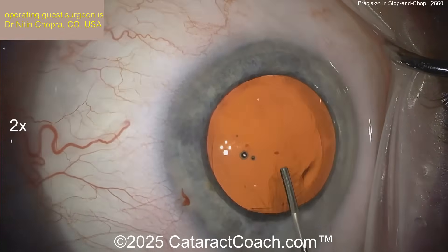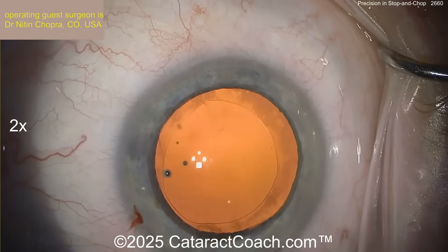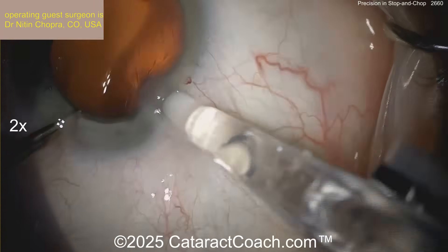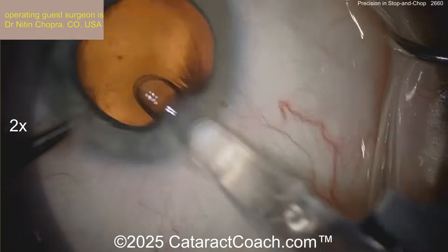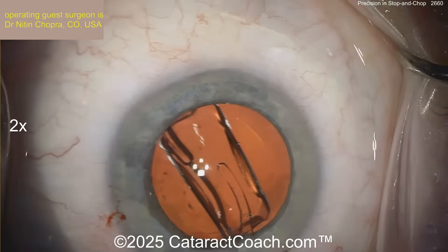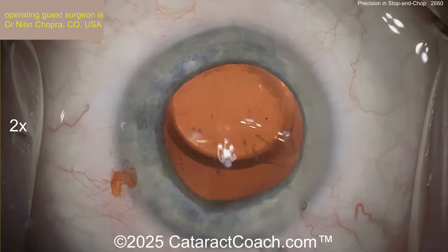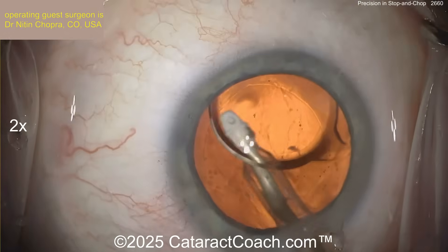A little bit more cleanup — that looks great. The patient is obviously under topical anesthesia. Here comes a cohesive viscoelastic filling the capsule bag. I tend to polish the undersurface of the anterior capsule, though studies have shown it probably doesn't make a whole lot of difference. Here comes a lens — looks like a single-piece acrylic lens, a monofocal single-piece hydrophobic acrylic. Perhaps that's the Tecnis-style lens. Deliver, deliver, deliver. Now going underneath it, removing viscoelastic, and we can finish up the case.